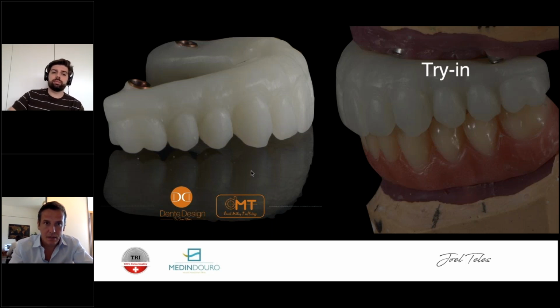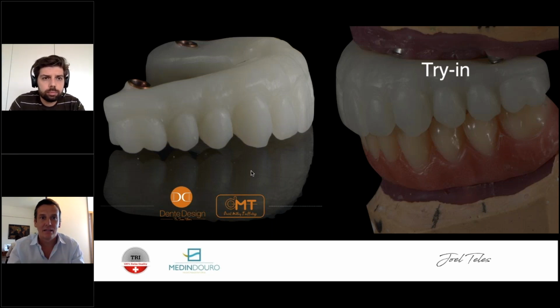So to this step, there were questions about the prosthetic design. There was the question, how can you know if you are at 30 degrees or 35 or even up to 40 degrees angulated with your distal placed implants? If the implant is too much or too little angulated and you use the 30 degrees angulated abutments, it doesn't matter if it's not really in a horizontal direction, because as you can see here in this molar region, the placed implants or the prosthetic part is still angulated, but due to the fact that the design of the abutments has a 15 degrees top part, you can also have a distance between the abutments which are looking out up to 30 degrees. So it is not necessarily important that you have a straight angulation from a 30 degrees placed implant. You can vary this depending on the case for sure.